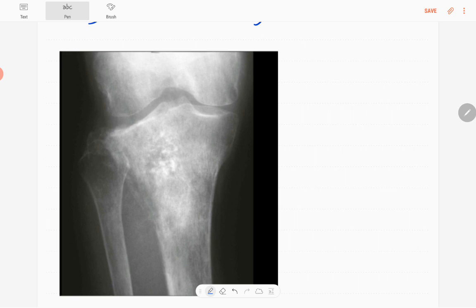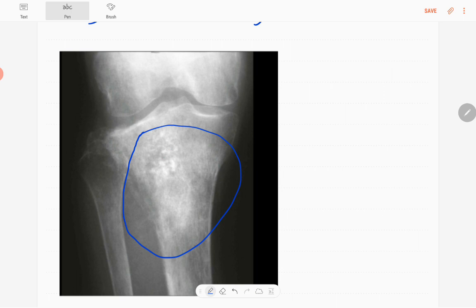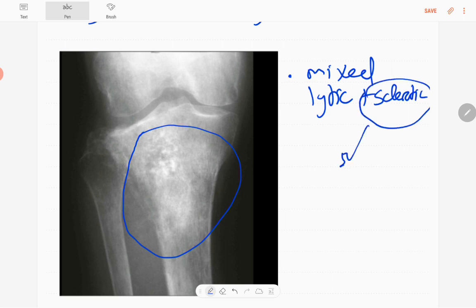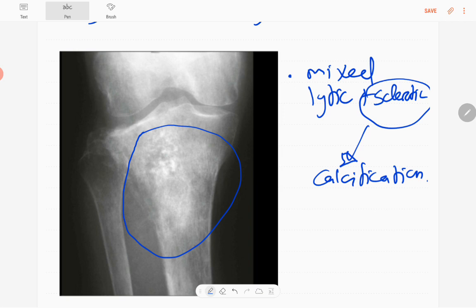The abnormalities are around the upper tibial metaphysis extending to the epiphysis. It is a mixed lesion with a lytic component and a sclerotic component. The sclerotic component is mainly matrix calcification — you can see ring and arc type of calcification.